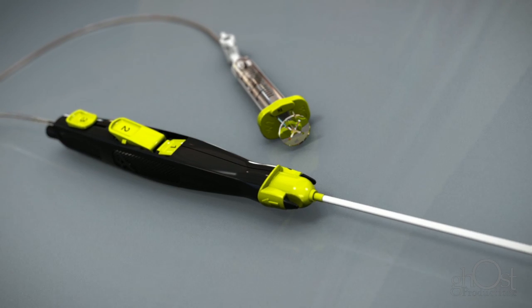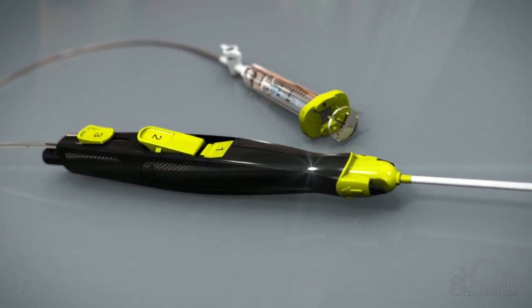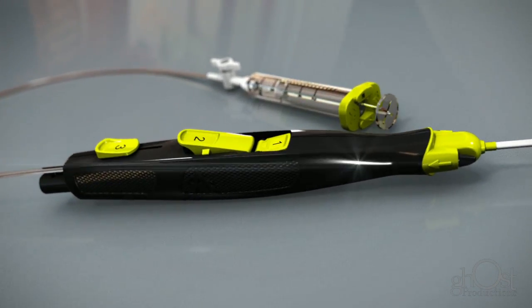The Minx Ace Vascular Closure Device from Access Closure, providing closure you can count on.